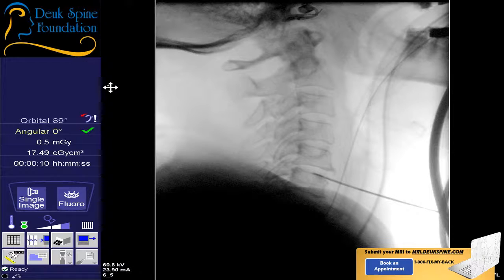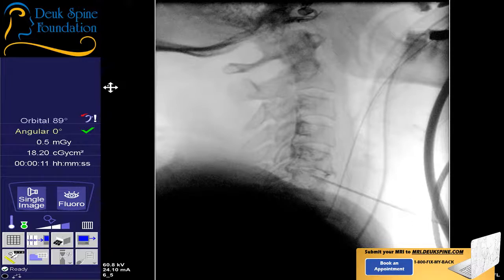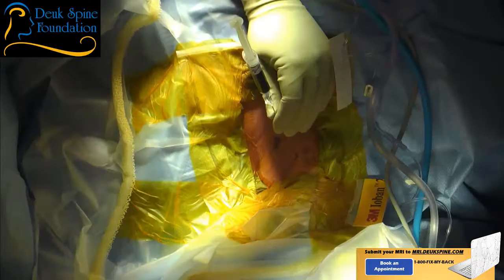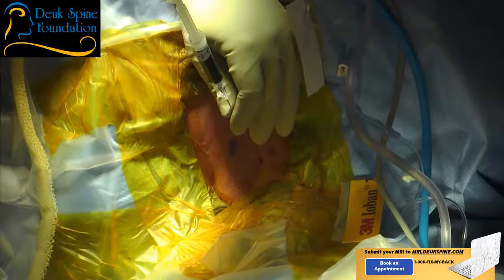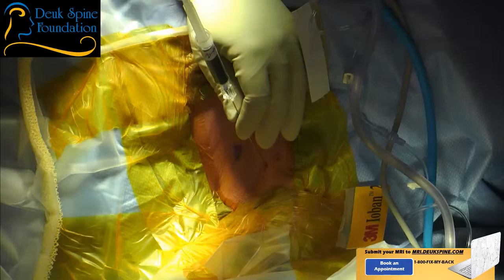She can't tell me what the pain response is for the discogram. We're not doing this discogram to find out her pain response. We're doing it because I want to inject a special dye that will stain the nucleus pulposus. You can see the herniation, by the way.